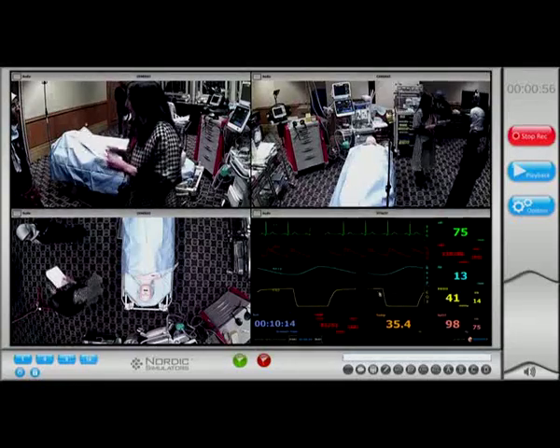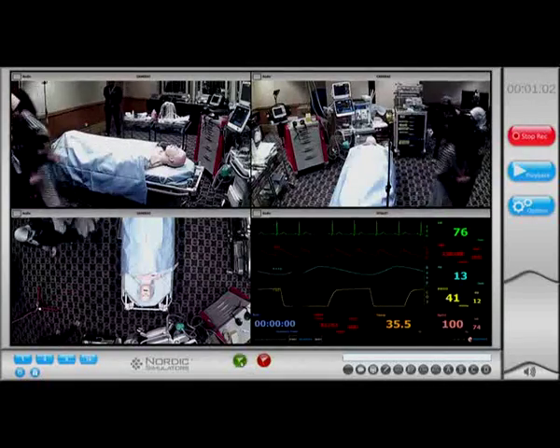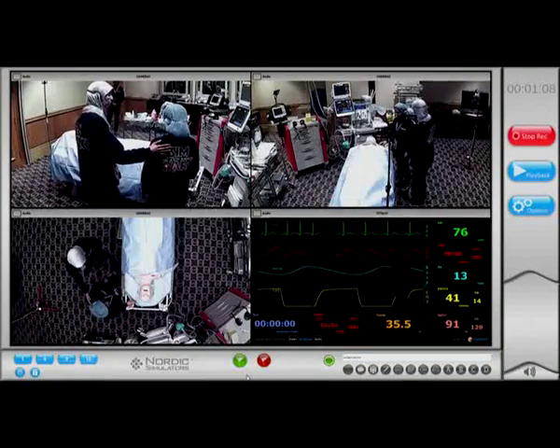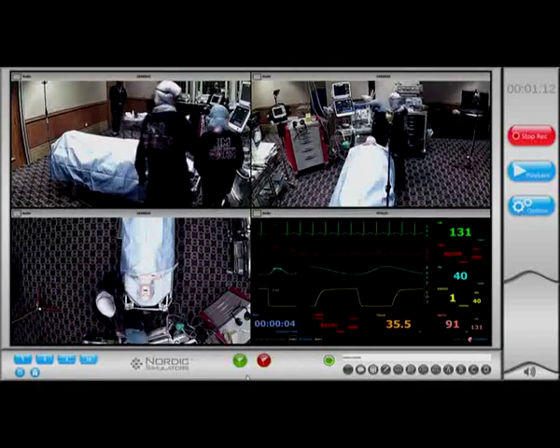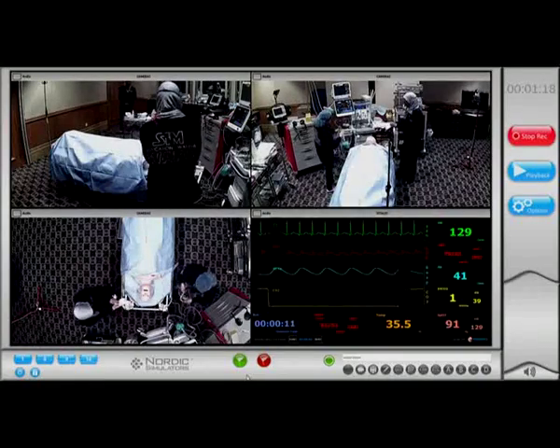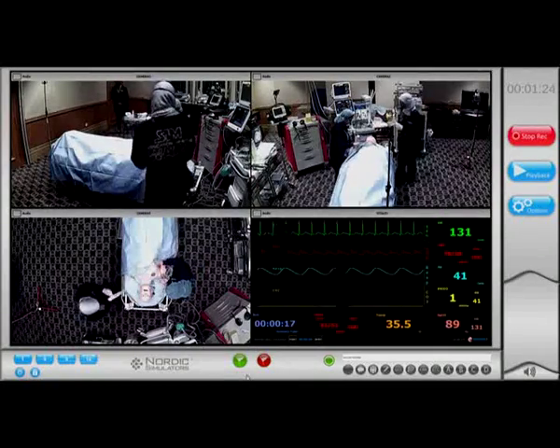You just arrived in the ER, and there is only a nurse standing there with the patient. So, good morning. Morning, doctor. By the time I assess the patient, could you please attach him to full monitoring, cardiac monitor, pulse oximeter, BP, and check it? Yes, doctor. And the 5-lead ECG, please. Yes. And after you finish that, obtain a large IV cannula and send blood for trauma workup, grouping, cross-matching and toxicology.